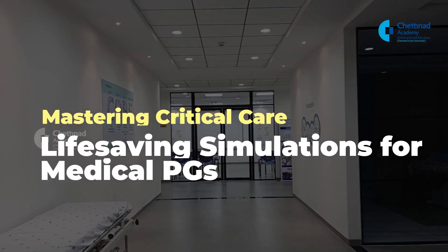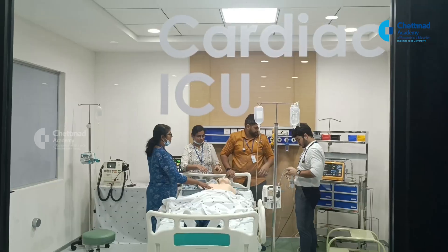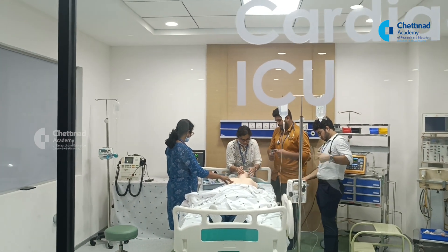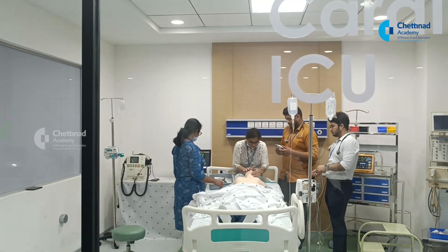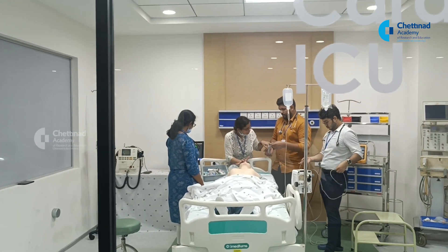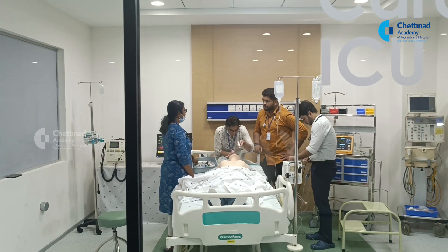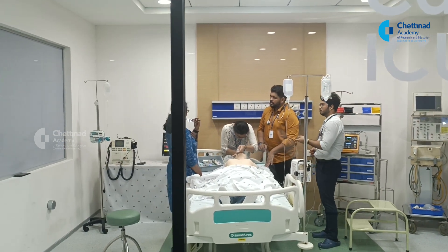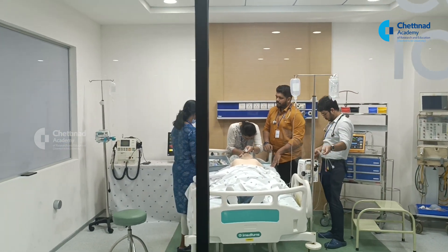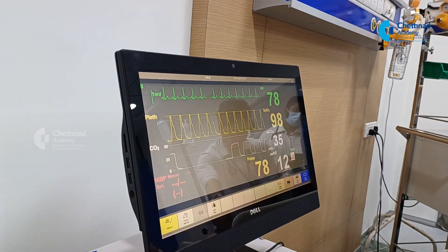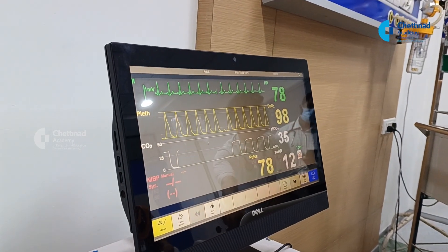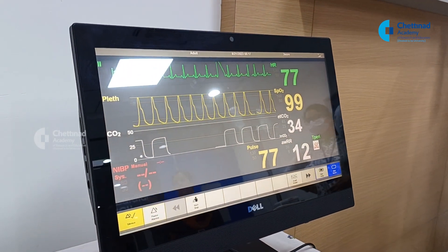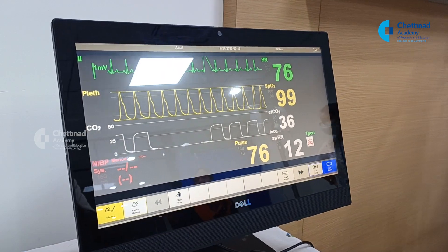Through lifelike simulations, we'll gain the expertise to navigate critical scenarios, fostering adapters in resuscitation, teamwork and quick thinking. This journey primes us to evolve into proficient and confident physicians. Today we will see a cardiac arrest simulation in the ICU. Let's get into the scenario.